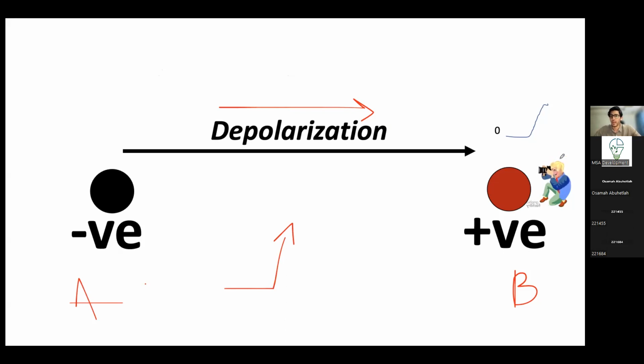All right. So as I said, ECG is basically you taking a photo of the heart from different angles, right? So let's say that we place that camera at the positive electrode, and it's taking a picture from there. So what is it going to see? It's going to see that a wave of depolarization is coming towards it. And so the ECG is going to represent it as a deflection going up, an upward deflection or a positive deflection. All right. So again, we're taking a photograph of the heart from the positive electrode. That's what you have to focus on, right?